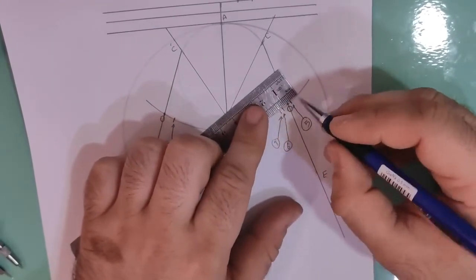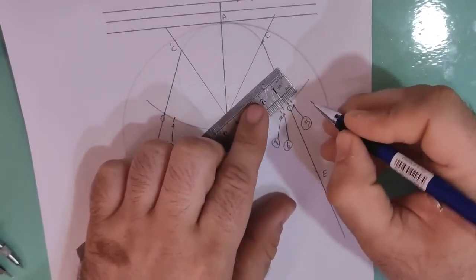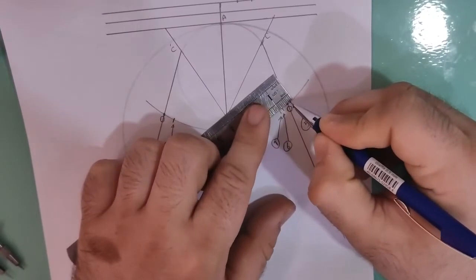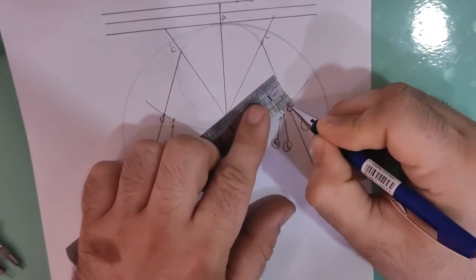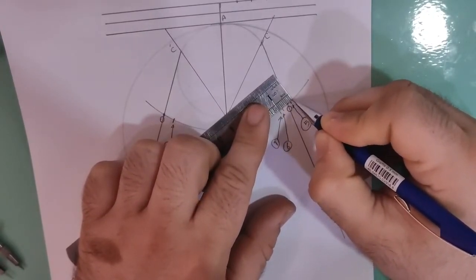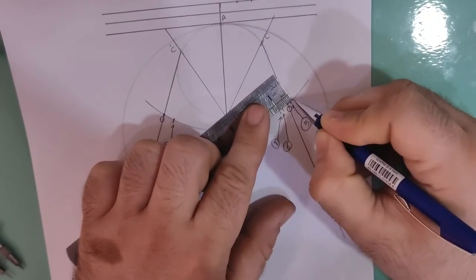Point three, the distance from zero is four millimeter. So one, two, three, four. One, two, three, four millimeter.